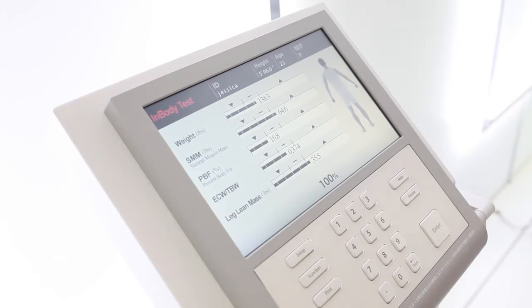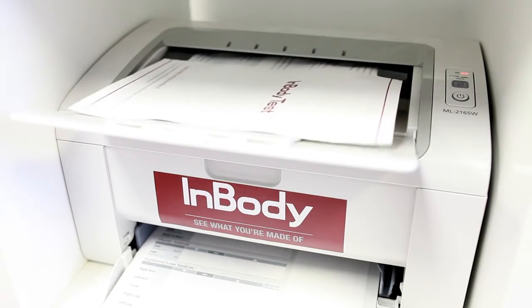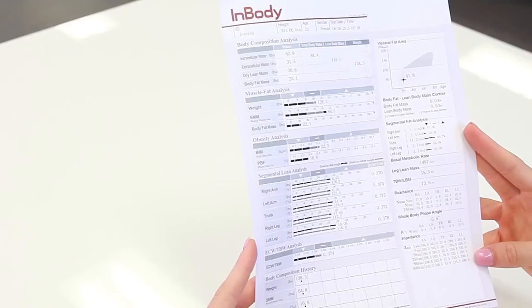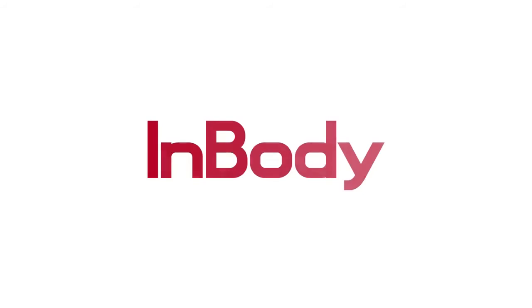Your InBody results will print automatically once the InBody test is completed. Don't forget to test again in two to four weeks to monitor and track your progress.